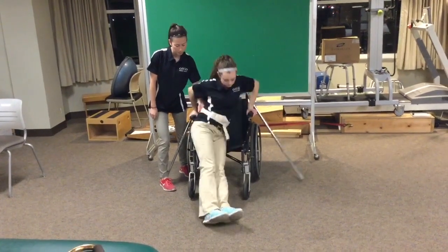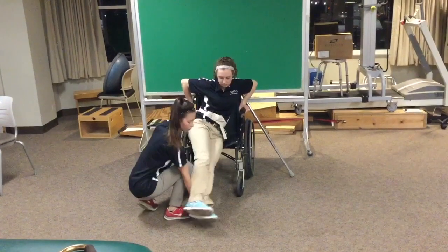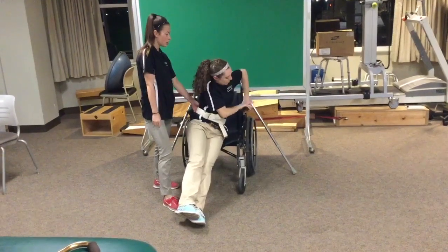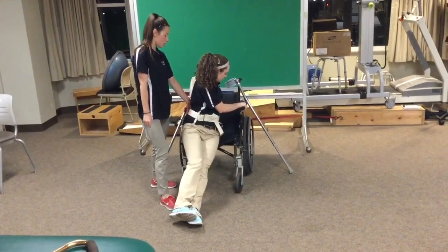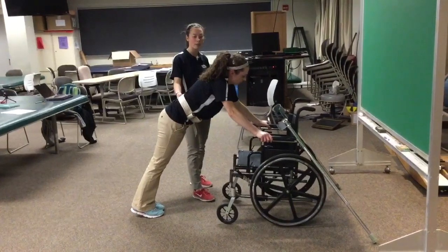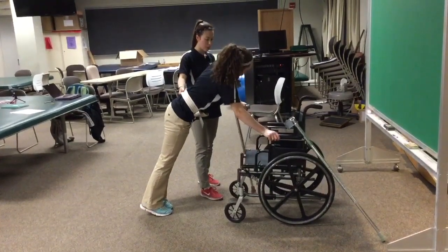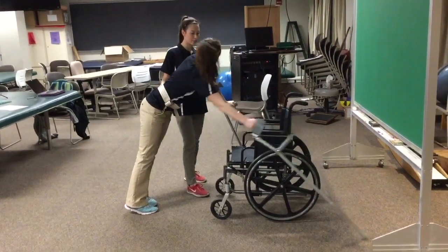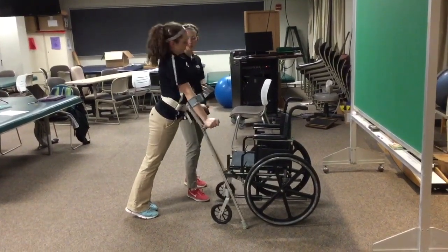Next, I'm going to have you roll onto your hip, position your feet to the center of the wheelchair, and back them. Now you're going to reach with one arm to reach the opposite side, and then reach with the opposite arm to reach the other arm of the wheelchair. Next, I want you to do a push-up so that you're facing the wheelchair. From this position, you're going to have your patient shift all their weight to one side and reach for the lofstrand crutch on the opposite side. After that, they're going to put all their weight through the crutch to reach for the other crutch, and then stand up by maintaining a C shape in their spine.